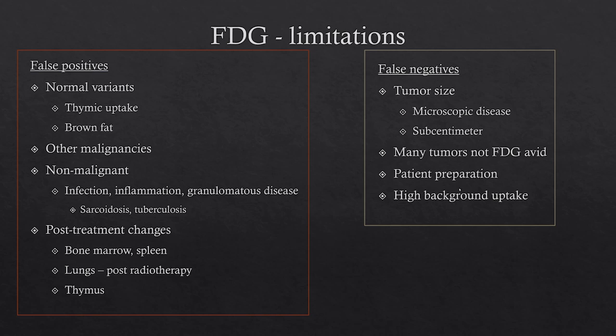If the patient did not prepare well, then the study may give you a false negative because FDG was not localized. Normal glucose is competing with it for uptake. If you have high background uptake, for example, a lot of gastrointestinal uptake, or a lot of excreted tracer in the urinary system, that may compete in finding abnormal uptake in those regions. If the patient's been exercising, you may see a lot of uptake in the muscles. It may miss something abnormal there.